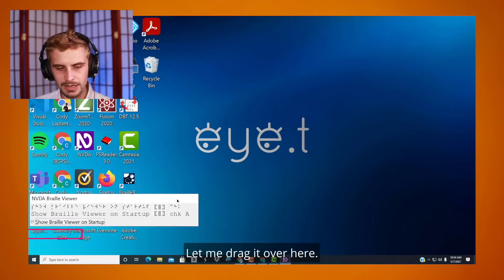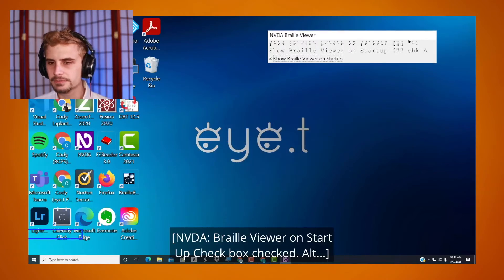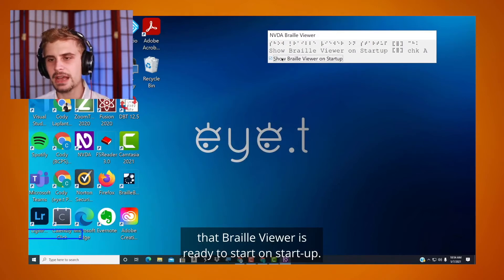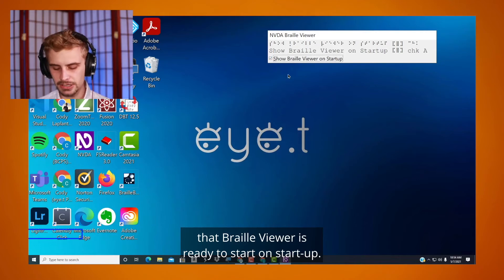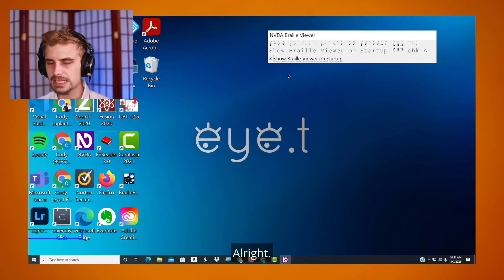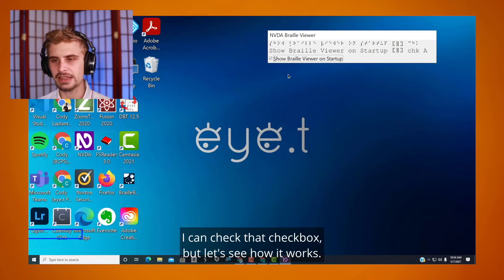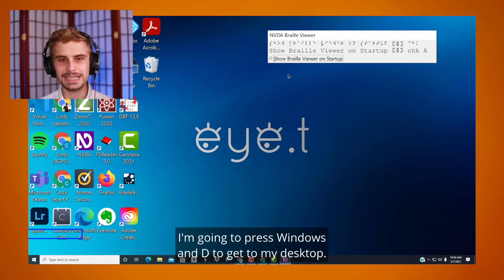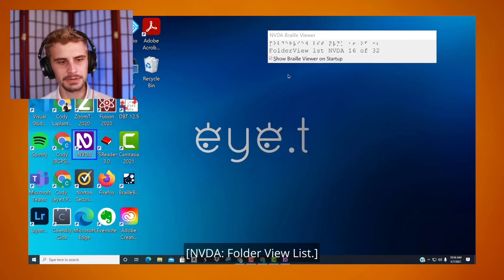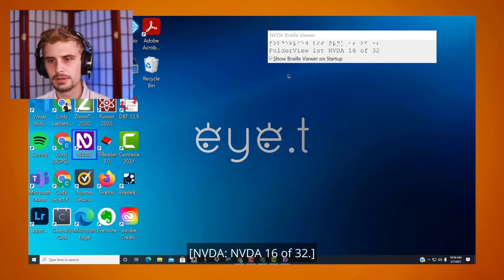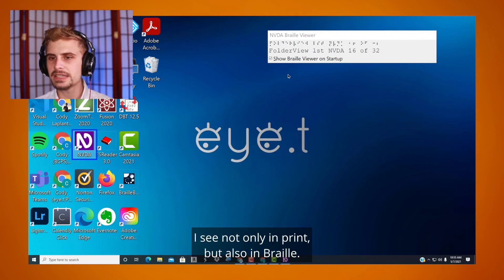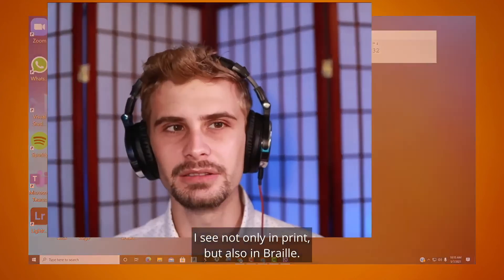Let's take a look at this Braille Viewer. There's a 'Show Braille Viewer on startup' checkbox. I have it set so that when NVDA starts up, the Braille Viewer is ready to go. I'm going to press Windows and D to get to my desktop. And now I can see that whatever NVDA says in speech, I see not only in print but also in Braille.